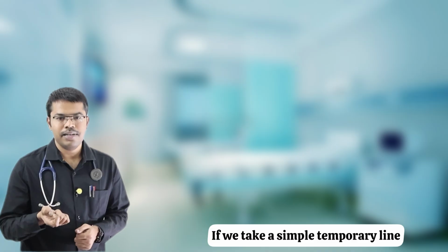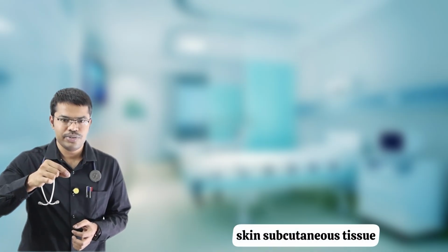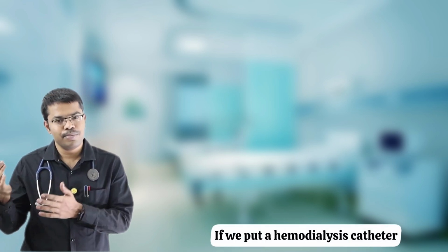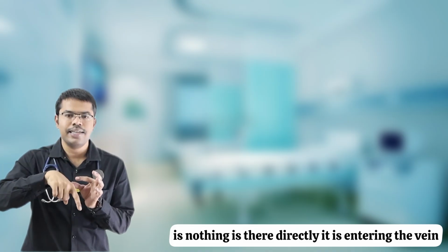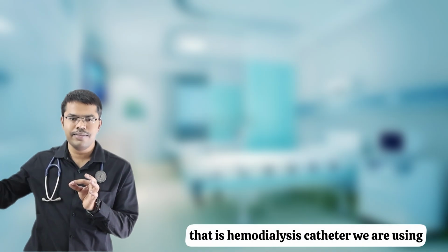If we take a simple temporary line, let us discuss only the internal jugular vein catheter. Similar to a central line, it goes through skin, subcutaneous tissue and enters the vessel. That is called a simple central line. If we put a hemodialysis catheter, it is just going from skin, subcutaneous tissue and blood vessel, so there is nothing else; directly it is entering the internal jugular vein. That is a hemodialysis catheter. We are using it for the dialysis.